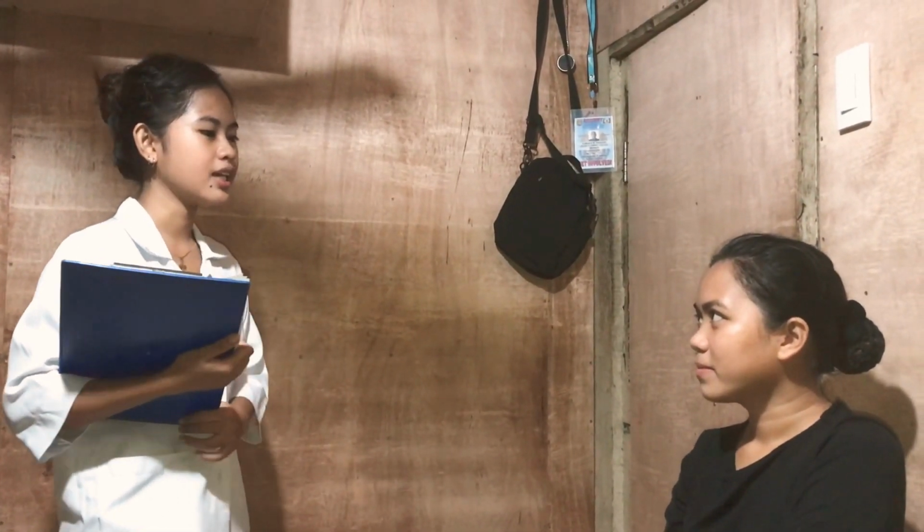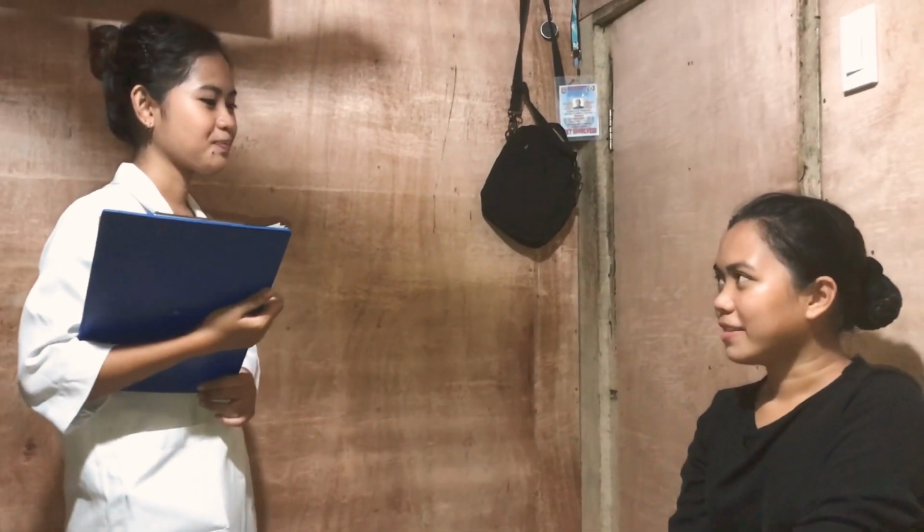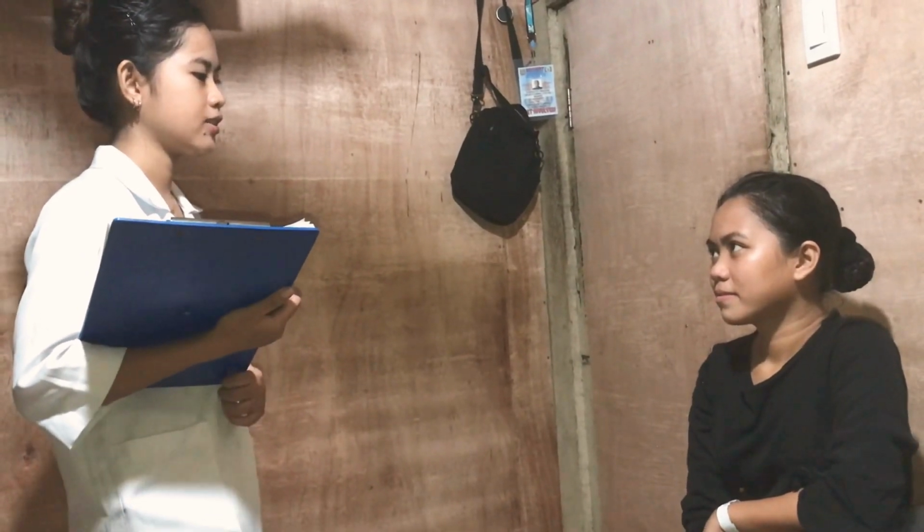Good day, ma'am. I'm Rina Buhan, your student nurse today. Is it okay with you that I take your vital signs today? Yes. So, the vital signs that I will take today are the body temperature and pulse, which is apical and radial pulse, and also the respiratory rate. And lastly, ma'am, your blood pressure. So, okay, thank you, ma'am.